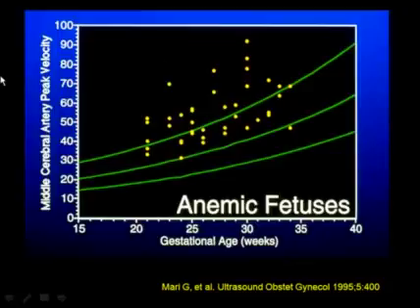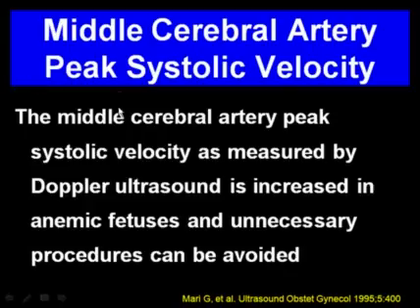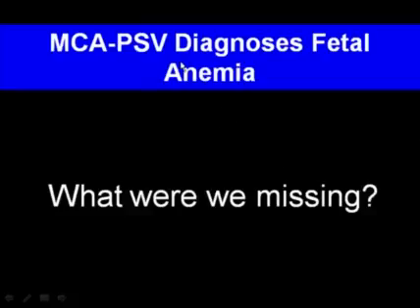We were a little bit disappointed when we saw this data. However, we said the middle cerebral artery peak systolic velocity, as measured by Doppler ultrasound, is increased in anemic fetuses, and unnecessary procedures can be avoided. There was something that we were missing.